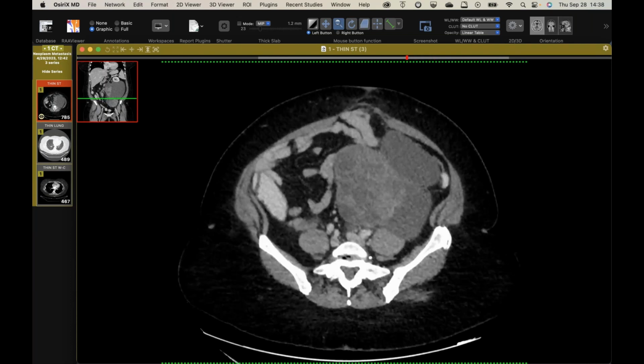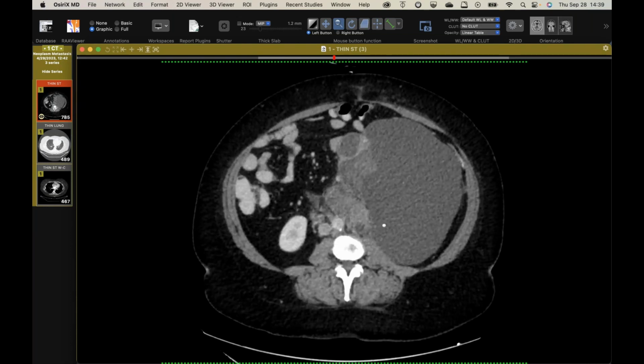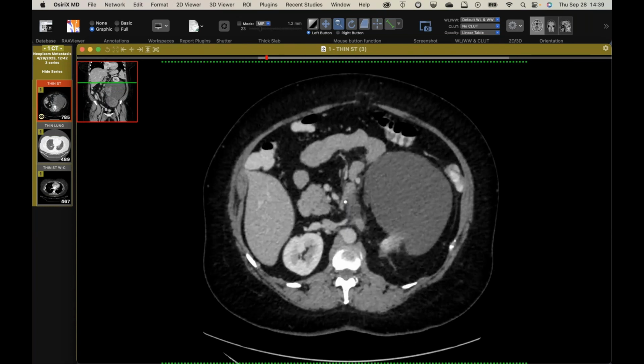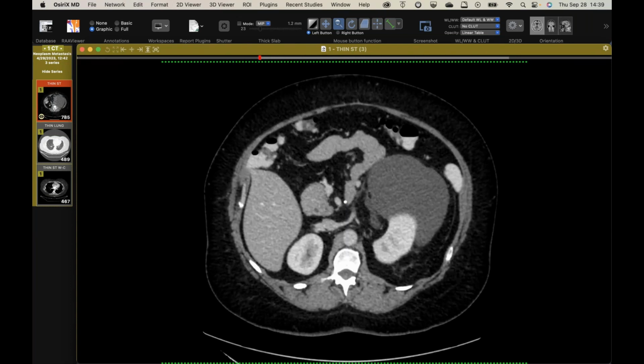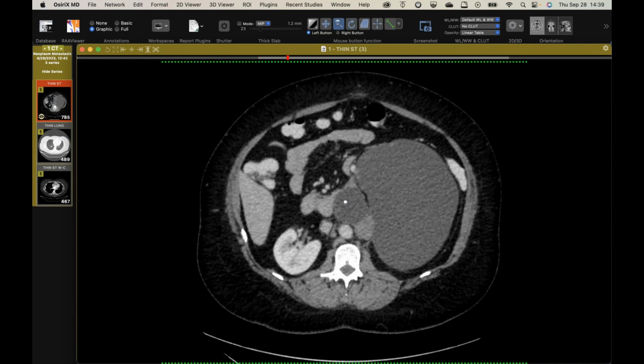And this one, I suspect it gets in the vasculature and works its way into the chest. You can see here it's trying to get towards, looks like, this large cystic component, but that's what I would suspect. It works its way into the IVC and then metastasizes to the lung. But I've only seen this a couple times, and again, there's nothing exciting about the lung imaging, but sometimes that old history matters, and I was looking in the literature, and almost every case is reported after surgery, not before. So it may be that during the hysterectomy or myomectomy or whatever, these cells get dislodged.